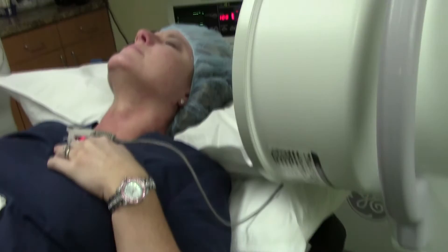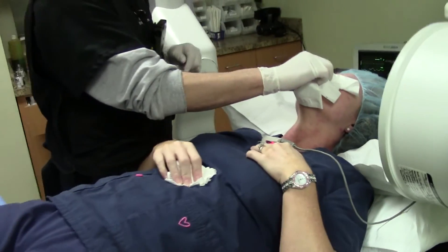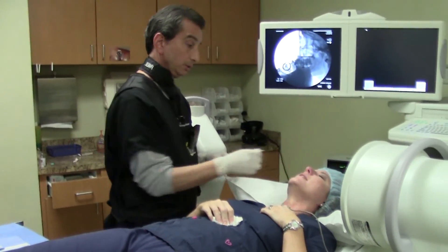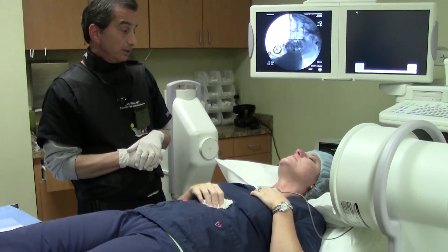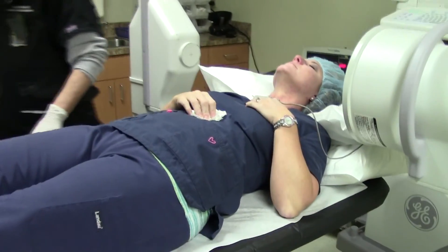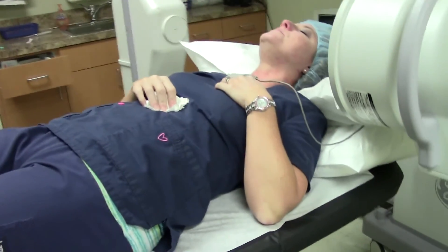Once the treatment is completed, we keep the patient supine with the neck slightly extended for approximately 10 minutes, and discharge them once they are feeling fine, as long as they do not have any residual numbness in the throat.